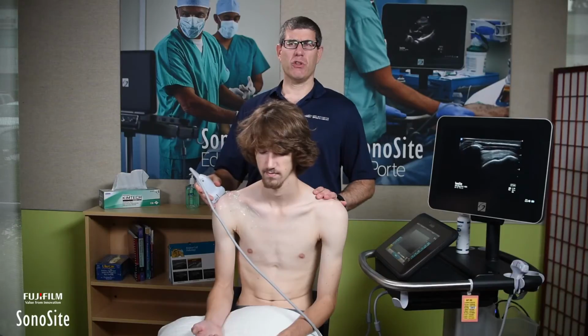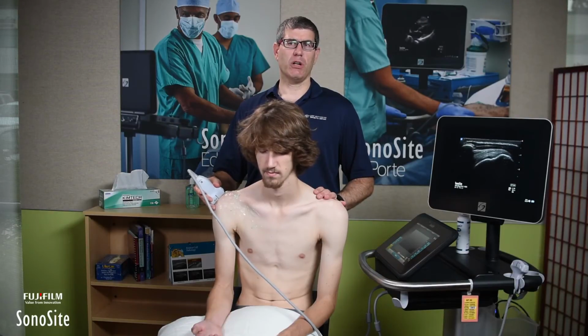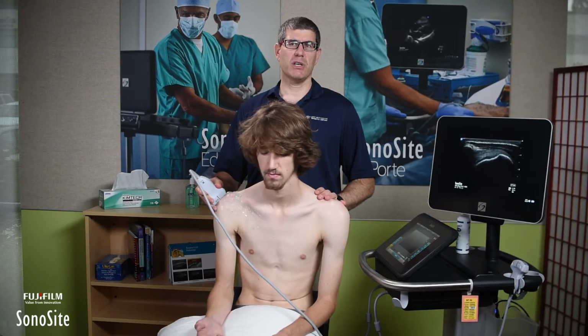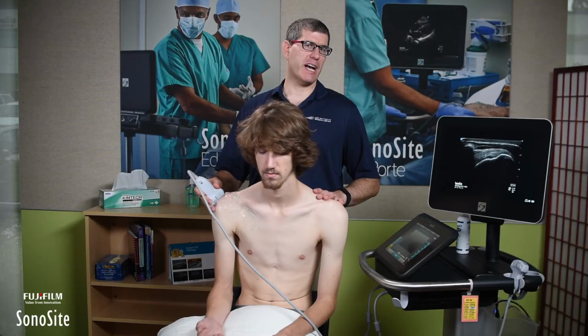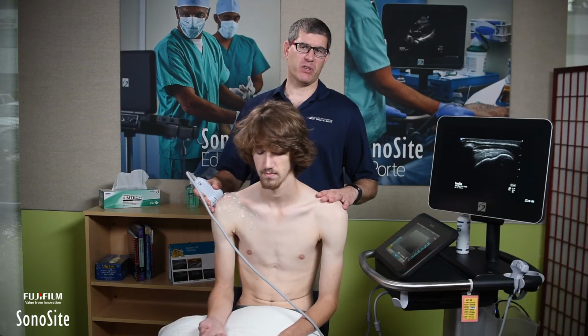So one of the things I want to do is look for clearance. I want to look at how much space I have between the lateral edge of the acromion and the lateral edge of the attachment of the supraspinatus onto the greater tuberosity. So I can just look at that baseline position.